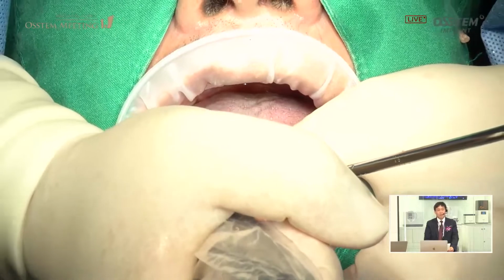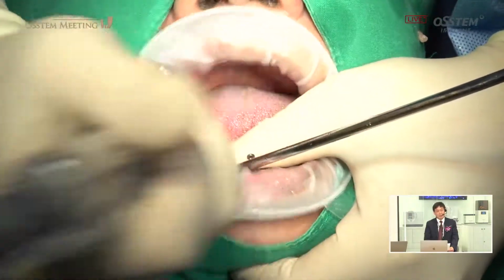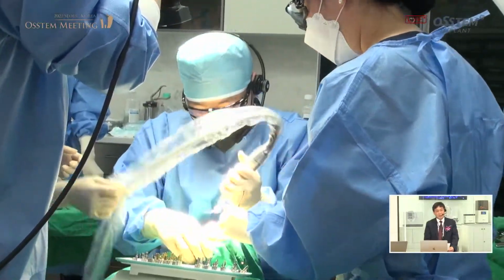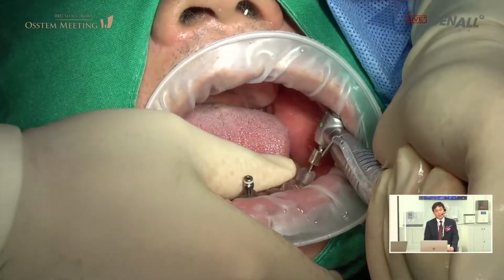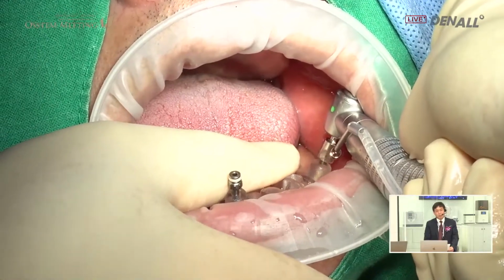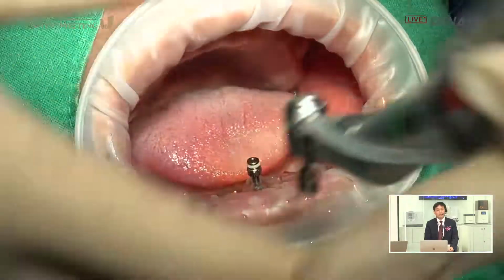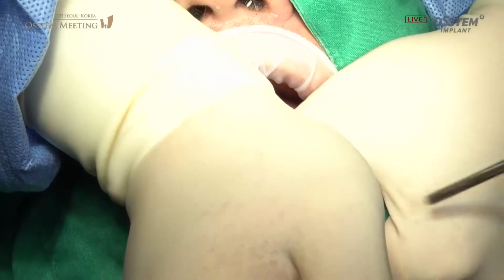He placed the one in the middle very first, and fixed at three points. When you fixate the lateral anchor, you make sure it's not tilted to one side. About 80% is being placed using the engine. Then fix the remaining ones.